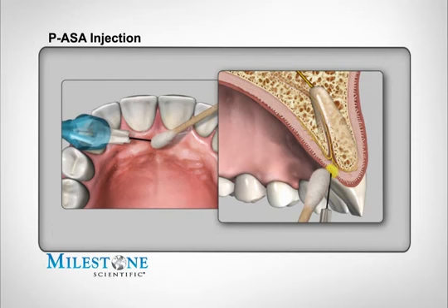The technique of allowing anesthetic to contact and diffuse through the outer layers of tissues will produce a topical anesthetic effect, numbing the surface. Do not allow the needle to puncture the tissue at this time. Continue to allow the needle to stay on the surface for another 5 beeps before initiating needle penetration.